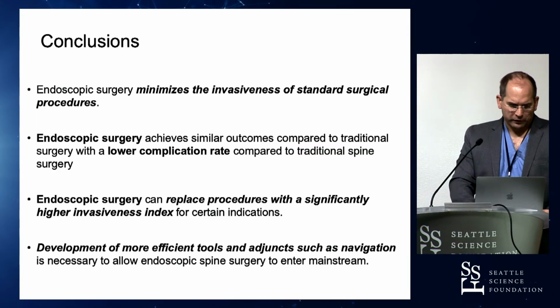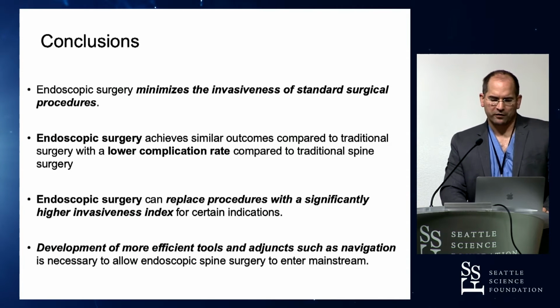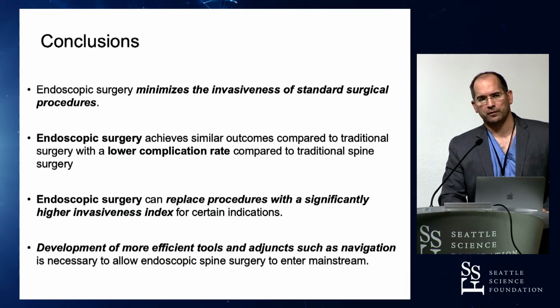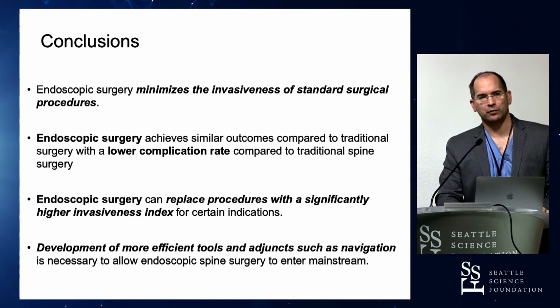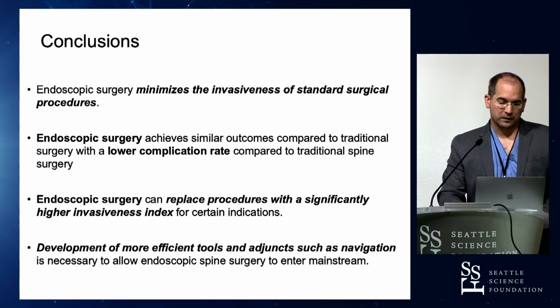Takes me to the conclusions. As we have seen before, this type of surgery minimizes the invasiveness. And again, I use it in my hospital because 30% of my patients have transplants, extremely sick, and I'm extremely proud that of more than 1,000 surgeries, we haven't had a single infection. Not a single infection in 1,000 patients, and a third are immunocompromised. It's a big deal. Ask your hospital administrators for that. Ask them, it's a big deal.